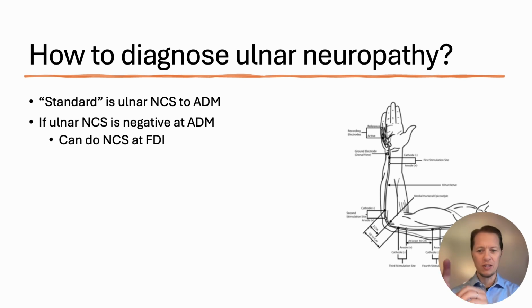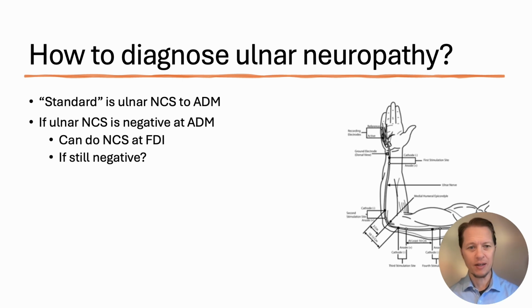And sometimes if you get the electrodes right, you can just quickly switch and go. Sometimes you can do 2 channel. Do them both at the same time. Does not waste any extra time for you. I would recommend it. But what if it's still negative, like in this case, but there's some pressing clinical history, which we haven't gotten into yet, that leads you to believe that something is going on?